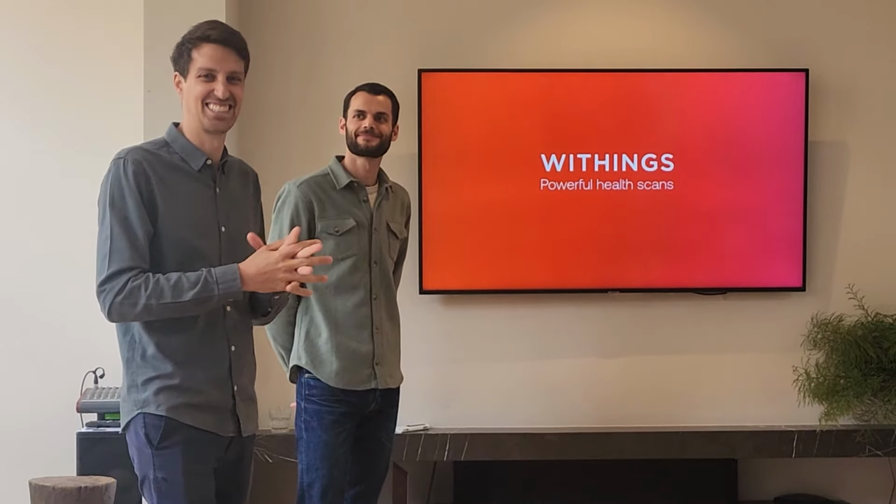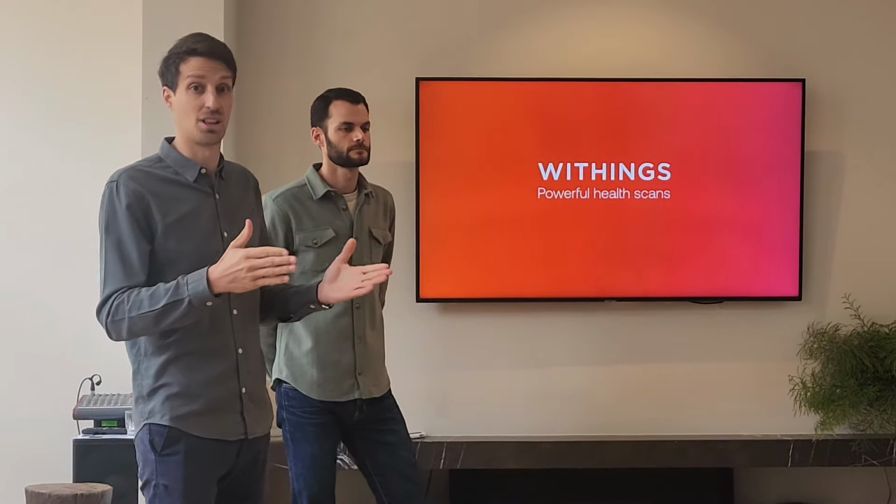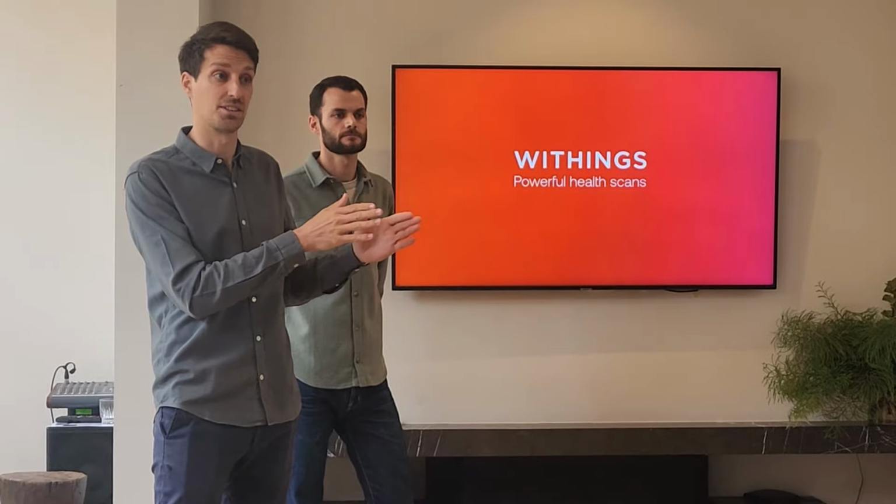But you're confident? 80%? That's quite high, no? I have no crystal ball. I cannot say for sure, but we have, I think, a good track record with the TGA. I think we're getting to know them better and better every year. We have many products on the field. They audit us on a regular basis to see what we call PMS, post-market study, in order to see in real life if what we claim is actually real. And in certain cases, we have to conduct post-market clinical studies in order to show that real-life data are in accordance with the clinical trial data that we submitted. So this is quite a long journey with those regulators, but I think it works.